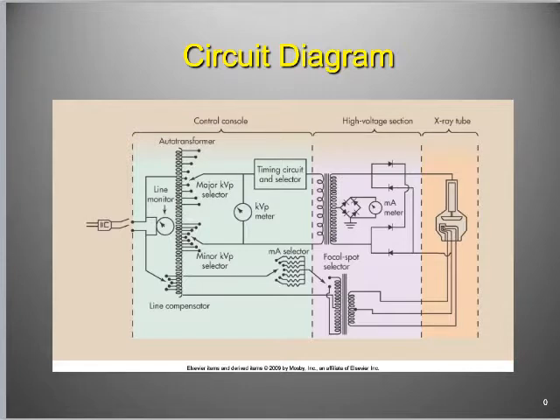But we are going to use that increased flow to produce friction, right? So if you can imagine, what we're doing is we're kind of funneling it towards the cathode. The cathode is this little tiny filament, and I'll pass the X-ray tube around in a minute. No, I'll leave it in the back, but you can go look at it because it's pretty heavy. This filament is very small, and it is made out of tungsten because it has to be able to release a whole lot of heat. When we turn it on, it's going to glow bright red.